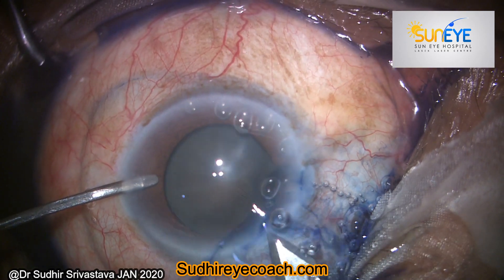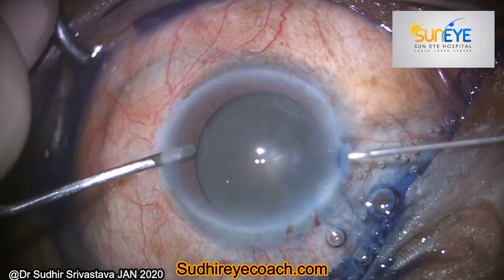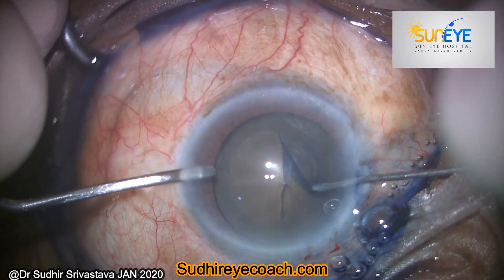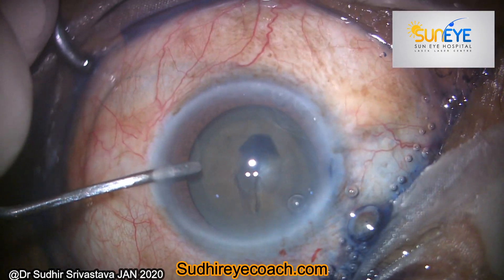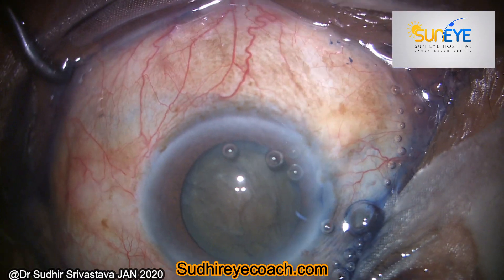So I removed all the air present in the chamber, filled the chamber tightly with viscoelastic, then started my rhexis. I planned a big size — around 5.5 mm and more than 5.5 mm — of my capsule rhexis. Then I performed very gentle hydro procedures.